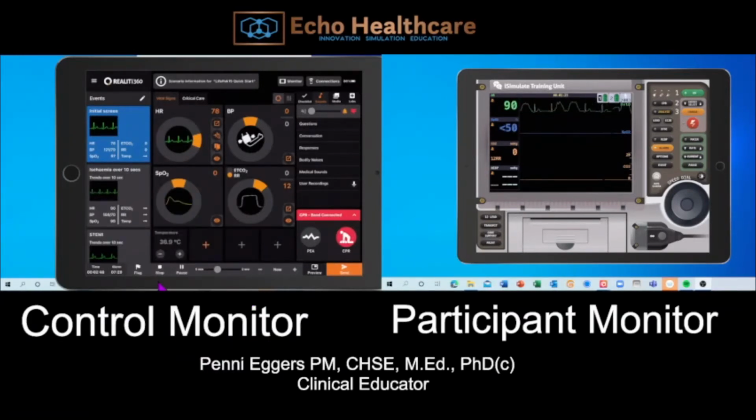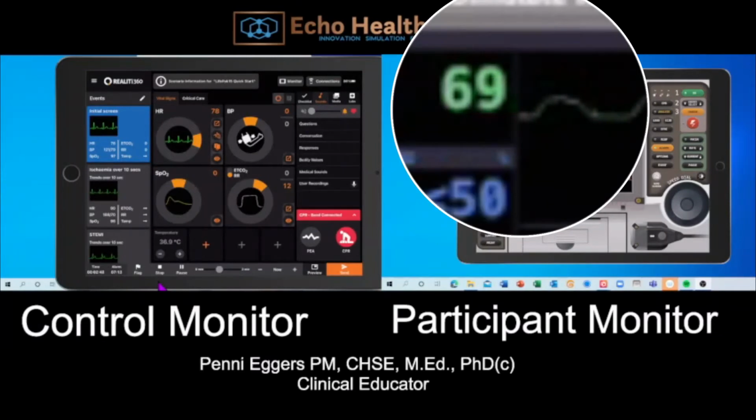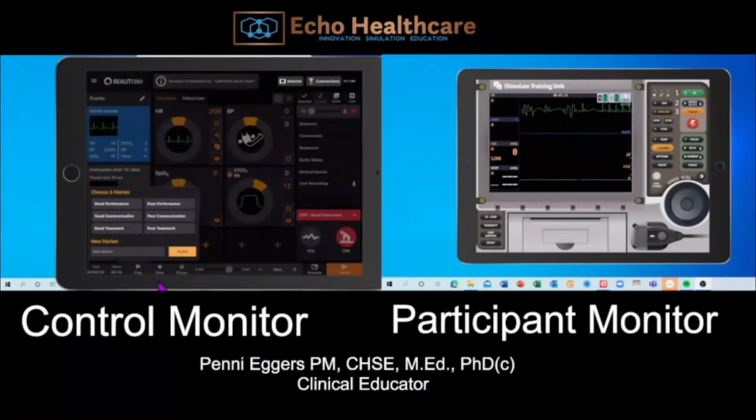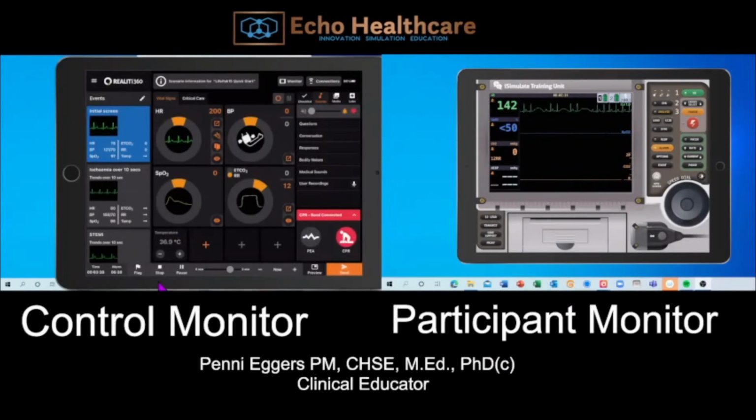And now I reassess my patient. I decided I need to go back to doing CPR. So now I'm going to do CPR. Now let's change the rhythm to, let's say, V-fib. I'm going to change the rhythm to V-fib. I'm stopping my chest compressions. I realize that the patient's in V-fib, and now the student is going to charge up the monitor and push the shock button, and then go back to CPR. And let's say I want to flag them for doing a good job of recognizing that the patient was in V-fib and that they had to shock the patient.